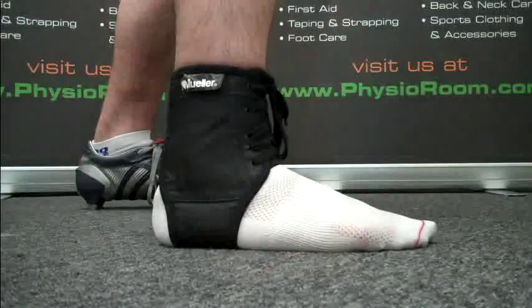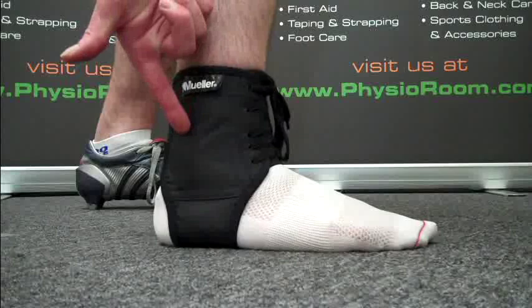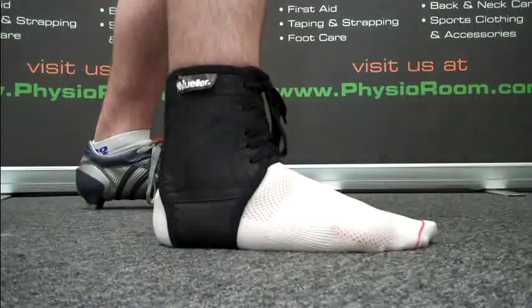Both sides of the brace are reinforced by lightweight, flexible steel springs. These help to support ankle ligaments and provide physical restraint to reduce the possibility of rolling the ankle.